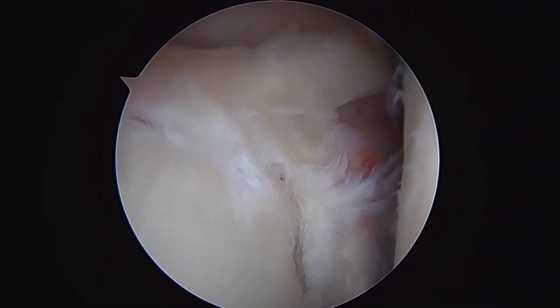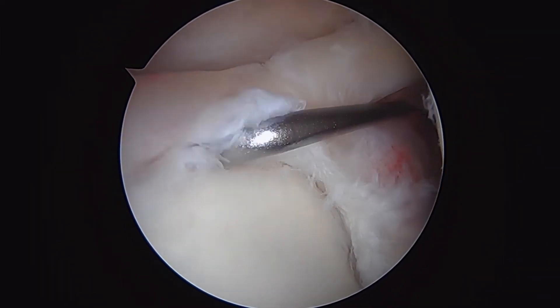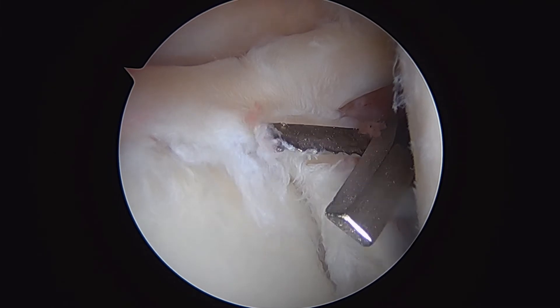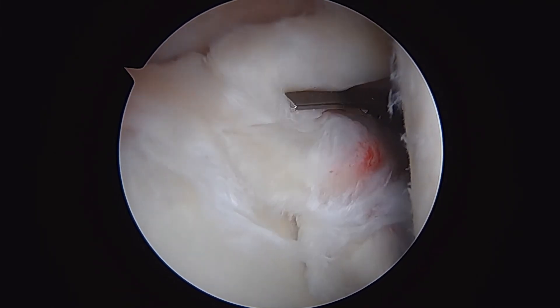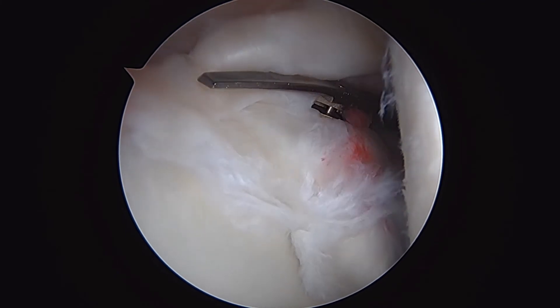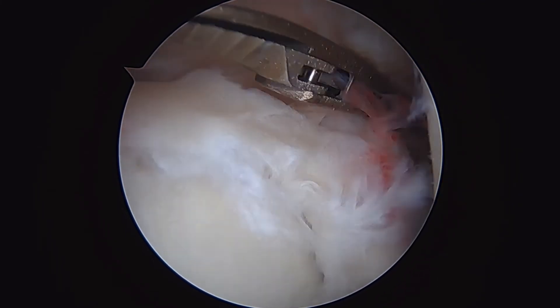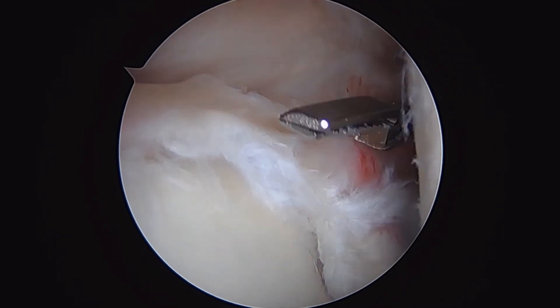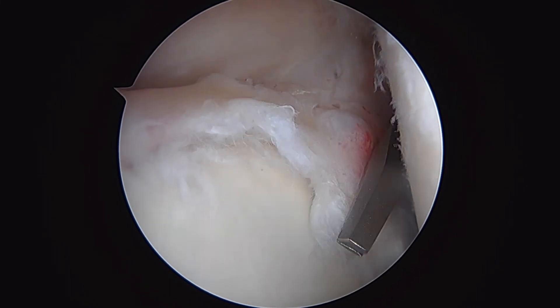This is a SLAP tear in a 47-year-old — we're going to do a biceps tenodesis. First step: we've come in with our arthroscopic scissors through the rotator interval. First step in managing this problem is a biceps tenotomy — cutting the long-headed biceps tendon to release it. You can see it's released, and then we're going to reattach it a little bit later in the case.